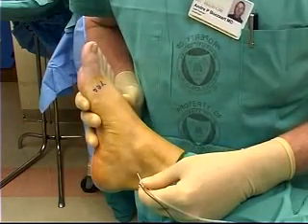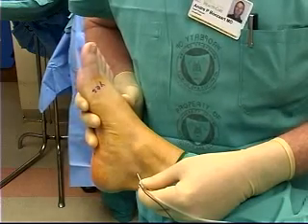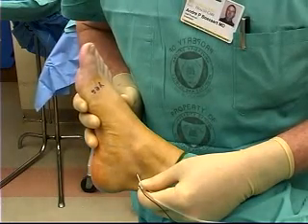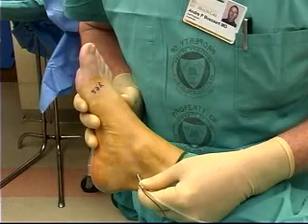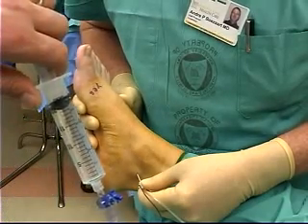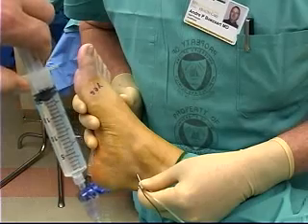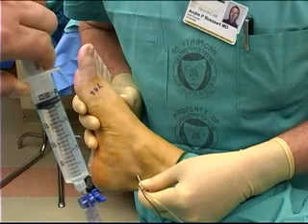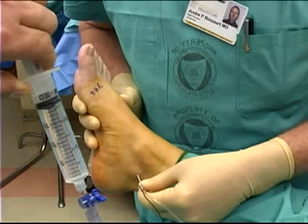A 22-gauge, 2-inch stimulating needle attached to a nerve stimulator set at a current output of 1 to 2 milliamps, 2 Hz, and a pulse width of 200 to 300 microseconds is used to locate the nerve. Toe flexion indicates that the nerve has been encountered. The nerve stimulator is now turned down so that the brisk motor twitches of the toes can still be observed at a current output of 0.3 to 0.5 milliamps. This may not be possible in diabetic patients due to diabetic neuropathy, where much higher currents may be required. The motor response will immediately cease upon injection of local anesthetic agent.